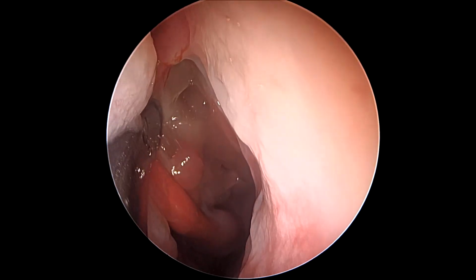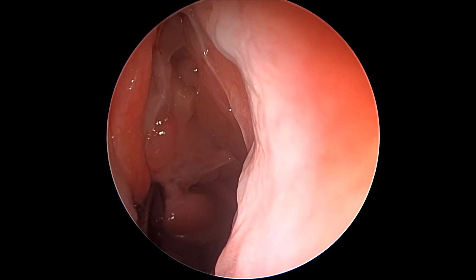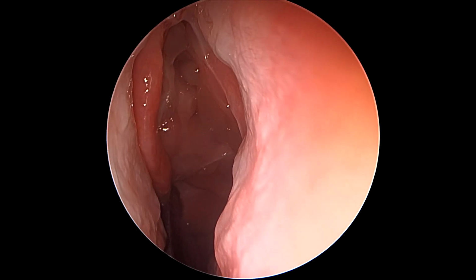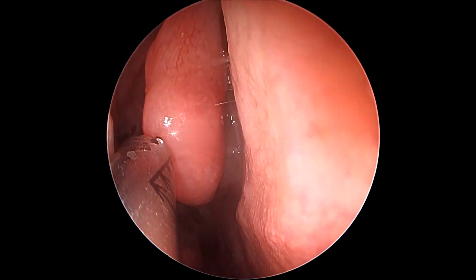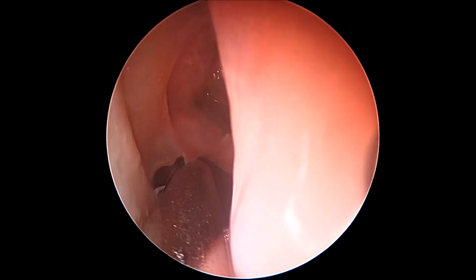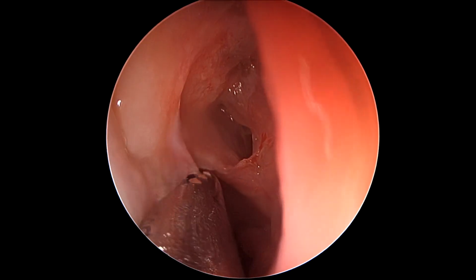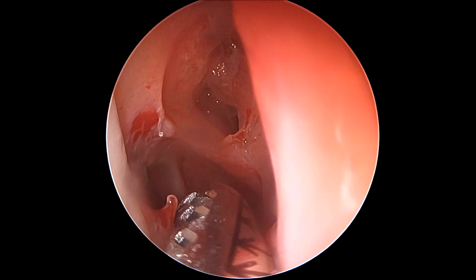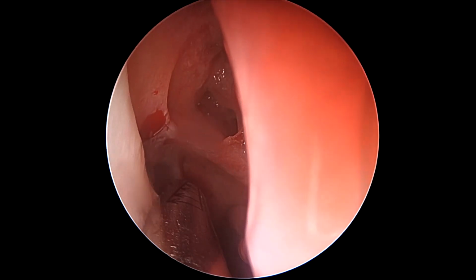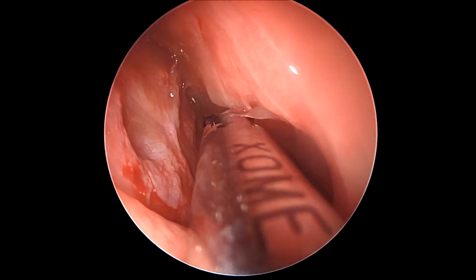As you can see, some polypoidal tissue, some scar tissue in both the middle meatus in this patient, since it is a revision surgery. And as always, all the possible causes of revision must be addressed if we are to avoid further recurrence in this patient. So we begin by identifying the antrostomy, ensuring that it is wide enough for not just irrigation, but also for adequate identification of the landmarks.